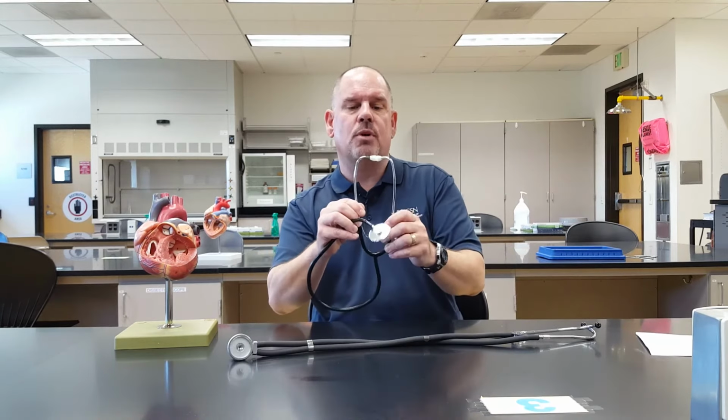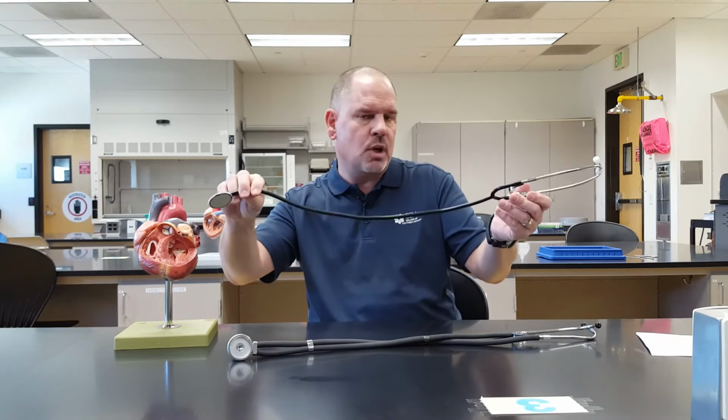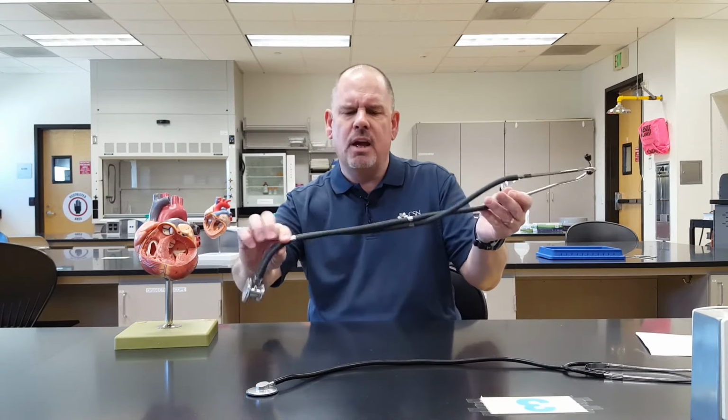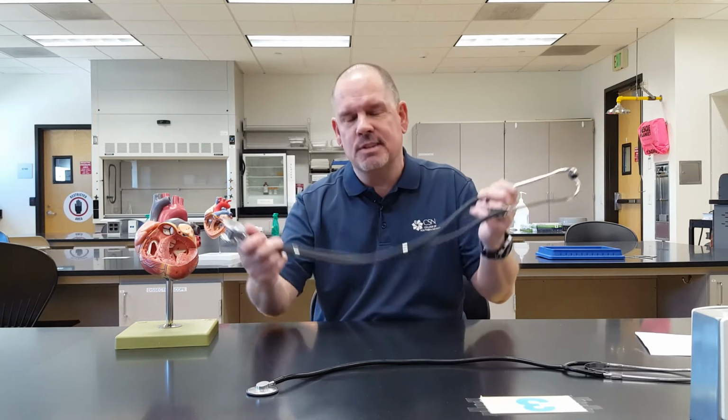How do you listen to them? Well, you do that using a stethoscope. And I brought two in here to show you. Actually, one was already here. I pulled this out of one of my lab drawers. This is the student stethoscope, aka a piece of crap. And then I brought my own stethoscope down here from my office. Very nice, solid, heavy head or bell on this thing. This is a good stethoscope for you to listen to heart sounds with.